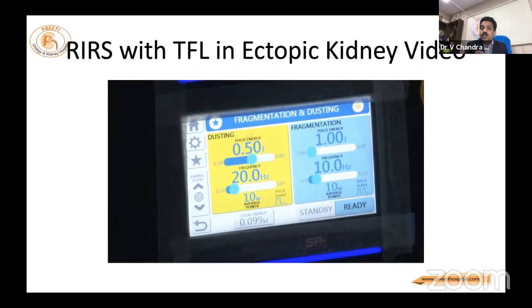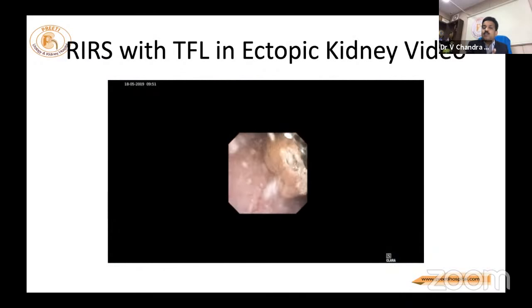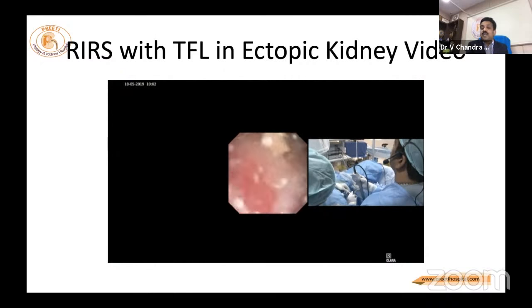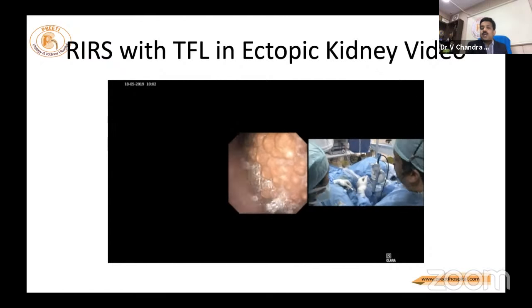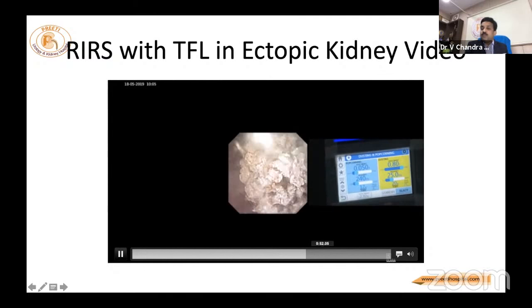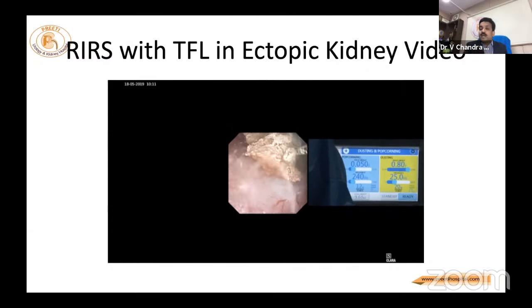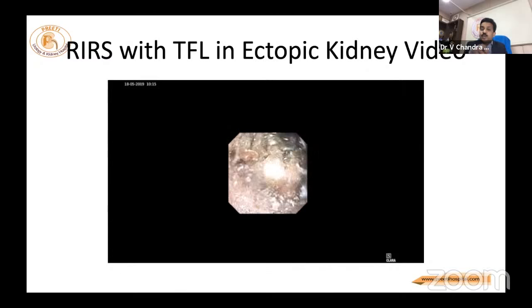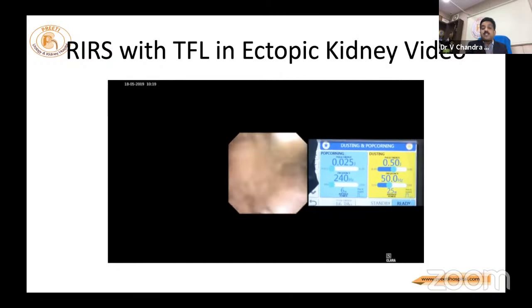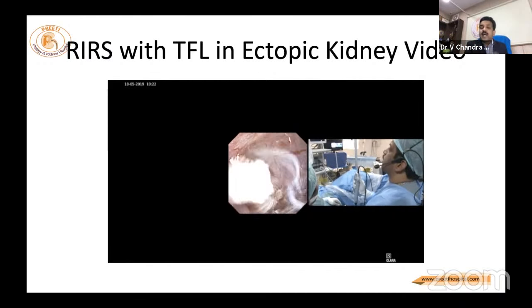You should always do the small stone first, because in the midst of the powder, it may not be seen. This small stone is not moving, no retropulsion here. After some time, it moves when the volume is very less. Now I am going to the main stone, and if you continuously do one layer like in a book, never decrease the surface area, to decrease the retropulsion. One more advantage in thulium is that in the pelvis, you can do localized popcorn. Normally, it is difficult with holmium because it burns and fragments move away very fast. Here, they come back. It has a suction effect because of the high frequency.